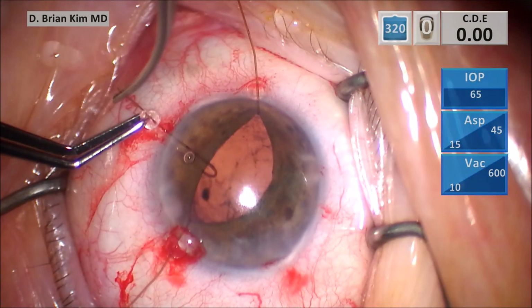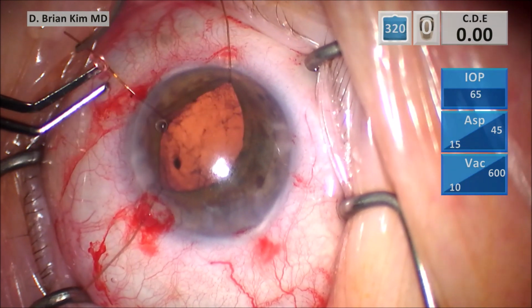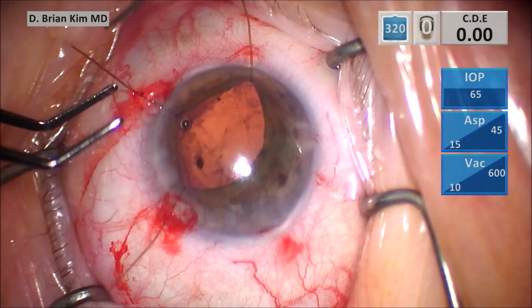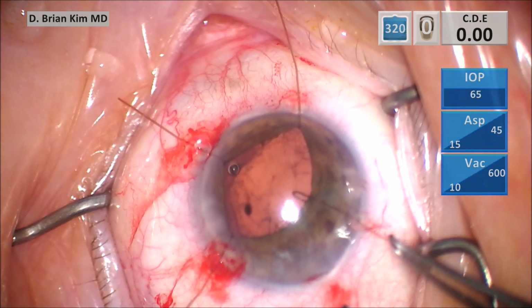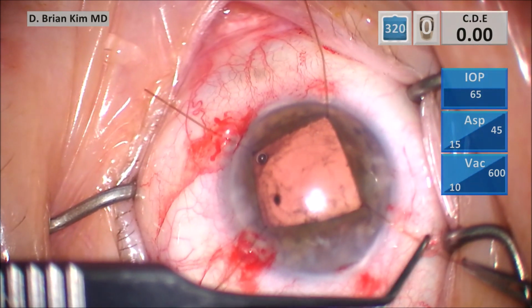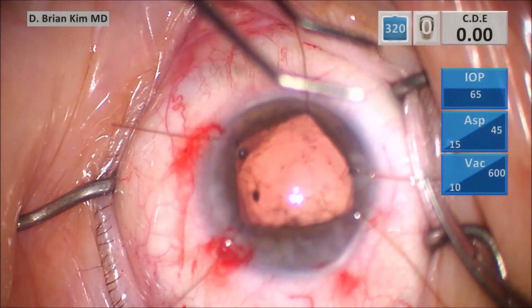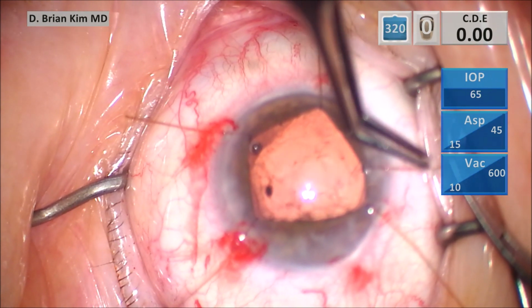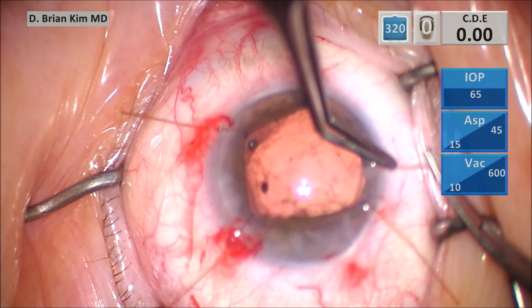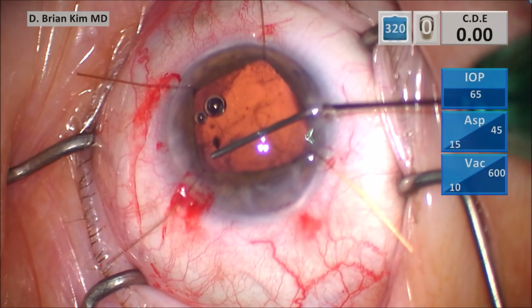So again, I'm placing these iris hooks with a two-handed technique, and just rotate your wrist so that the hook points down, and then you can catch the edge and hook it and then cinch down the stopper. Once the pupil is dilated sufficiently so I can see the entire anterior and posterior capsule, I can see that I have adequate rhexis, essentially 300 degrees, except for that one segment, about 1 to 2 clock hours, where I have that anterior capsule tear.